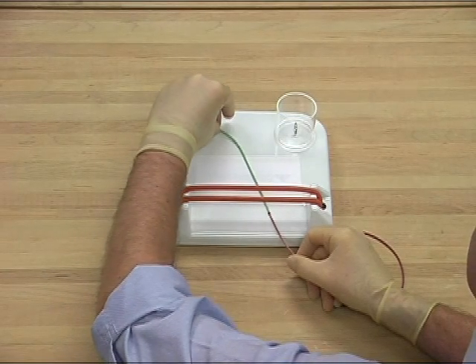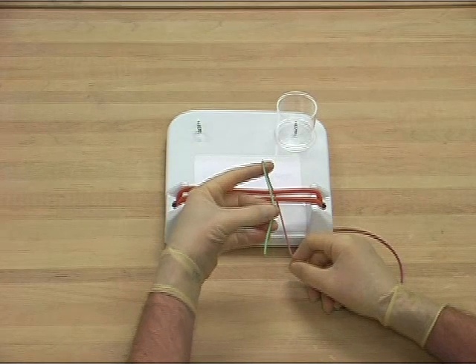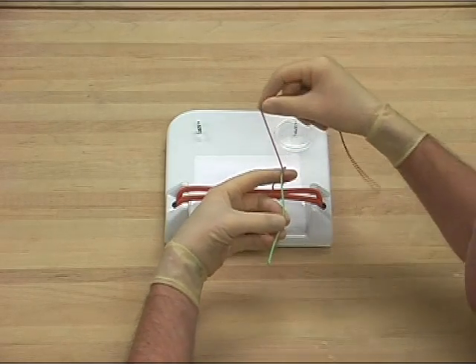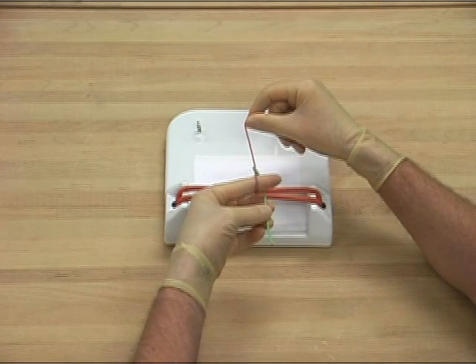With the hand in a prone posture, the end of the suture is picked up between the thumb and the long finger and pulled towards the surgeon. In doing so, it is laid over the index finger. The other limb of the knot is then crossed over the index finger and, using the back of the nail of the index finger, the ligature is passed through the loop created and passed back into the holding hand.